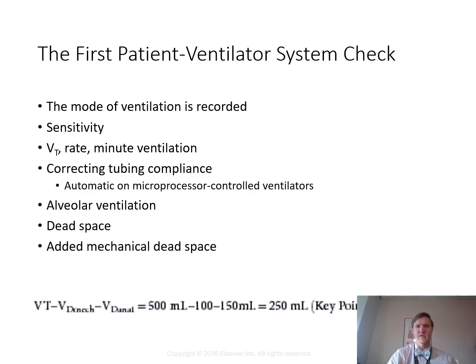All right, so when we're looking at this, the mode is one of the first things that we do. We need to say, hey, what mode did we put the patient in? That's going to be the big thing, because we would need to know how their breath is being delivered. It's kind of an important thing. So the mode could be volume controlled CMV, volume controlled continuous mandatory ventilation. That means the patient's getting full support and we're using volume to dose the breath, how big the breath they're getting.